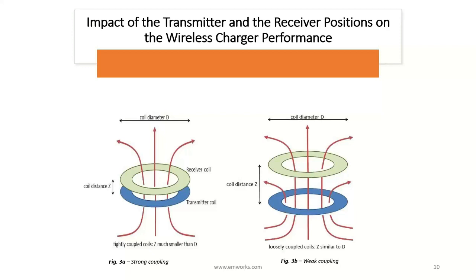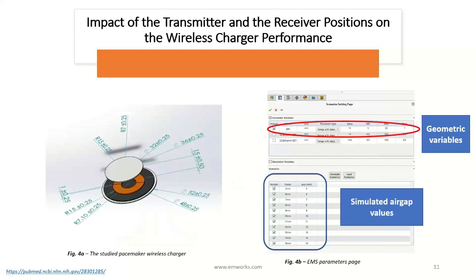In addition to axial air gap, the distance between both coils, the relative position of the transmitter and the receiver coils can have lateral and angular misalignment. All of these situations will be studied and discussed in the upcoming slides.